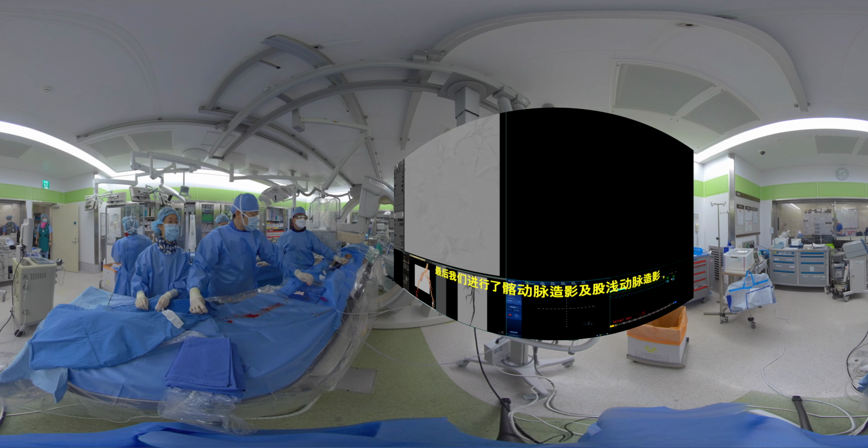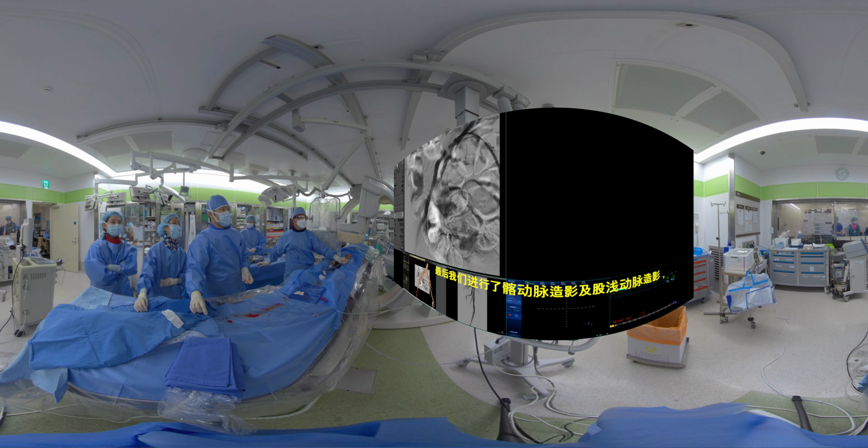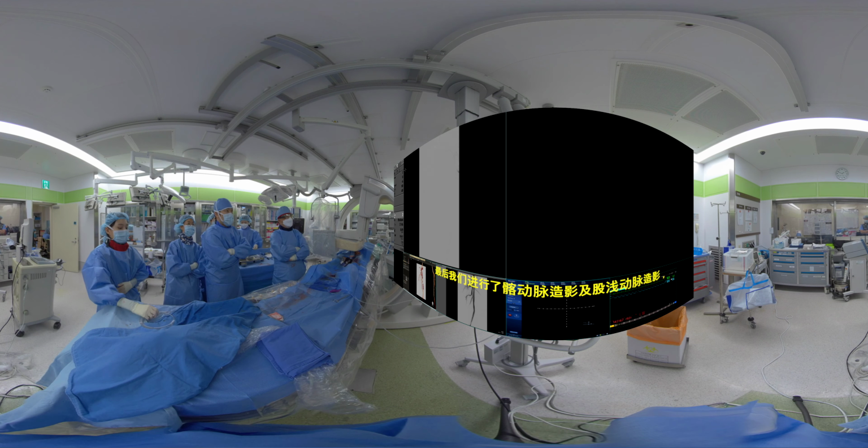A final angiogram of the iliac artery was done, and then another angiogram of the right SFA was done. Flow of both lesions was quite patent. The puncture site was closed by manual compression after the closure device failed. Ankle brachial index after percutaneous angioplasty of the right SFA increased from 0.3 to 1.04.